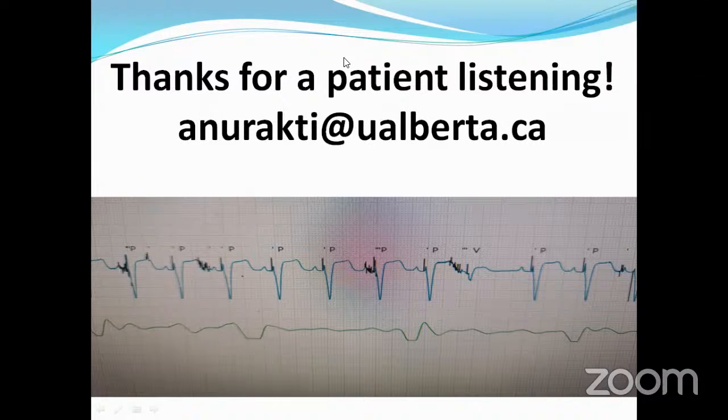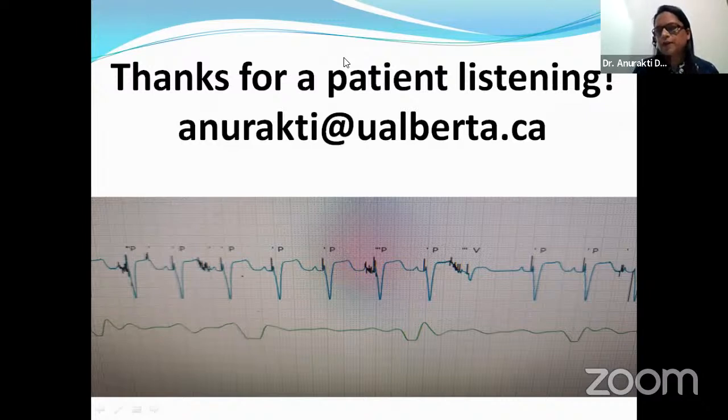Dr. Agnihotri is asking, what ECG electrode brands do you find ideal for long-term monitoring, 2 to 3 weeks? It doesn't depend on the brand. I'm not brand specific. Any of the electrodes are good enough. The only thing is the application should be proper. It depends on the patient. If they are sweating too much, the electrodes will definitely fall off. If it's a pediatric patient, it will fall off. So I don't recommend any brand. You just have to provide a set of extra electrodes to the patient and tell them where to place them.